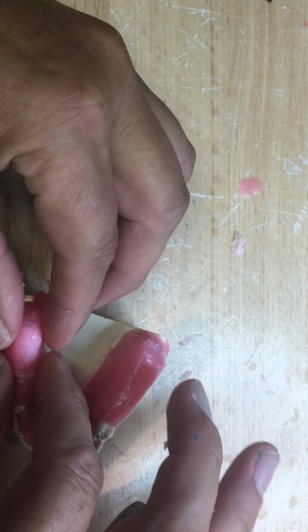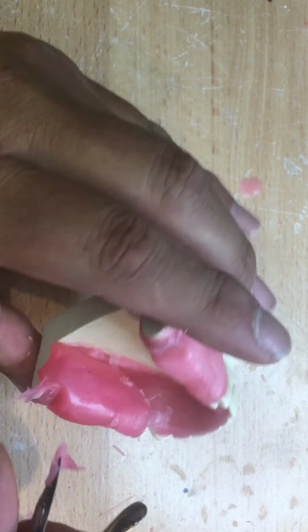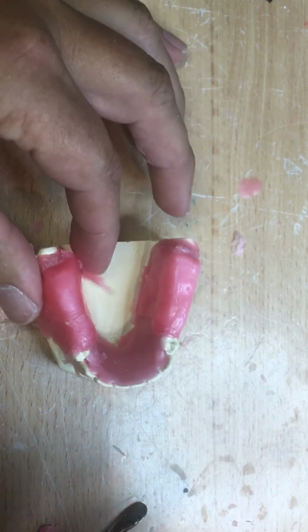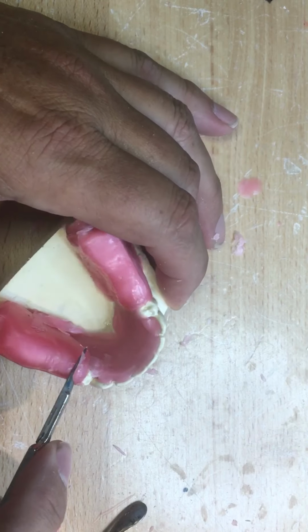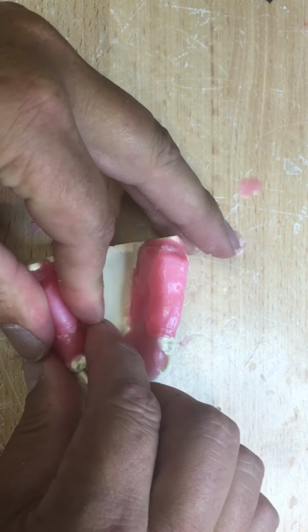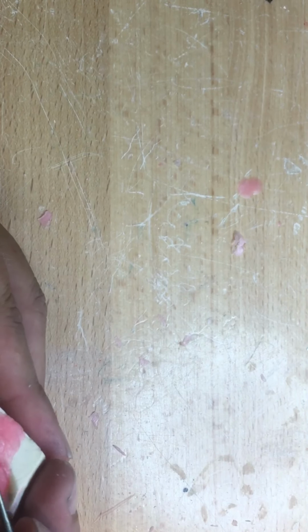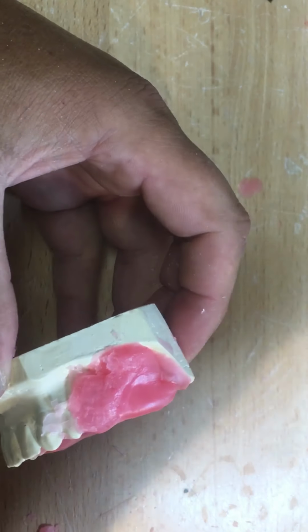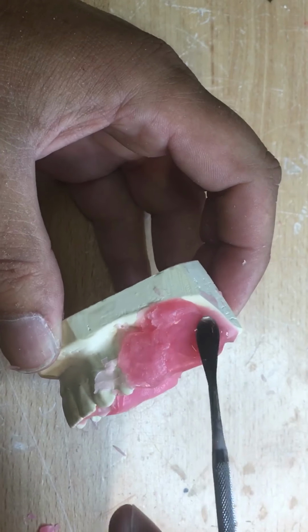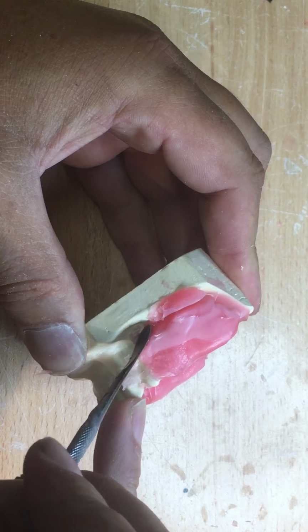How wide? Well, the width of the denture teeth, 8 to 10 millimeters, I think is our suggested width here in the posterior section. Right? Stay on top of the ridge, because these teeth on the lower, just like in full dentures, are going to be on top of the ridge, regardless of the type of occlusion it is. If it's class 1, 2, or 3, it doesn't matter. And then I'm going to... Oh, I'm off screen. I'm sorry. Ooh, messy. Yeah, the wax a little bit soft there.